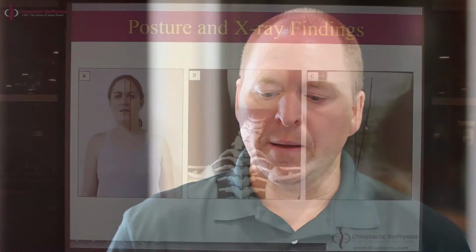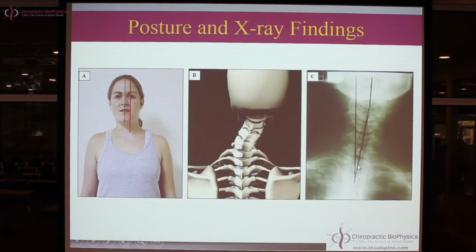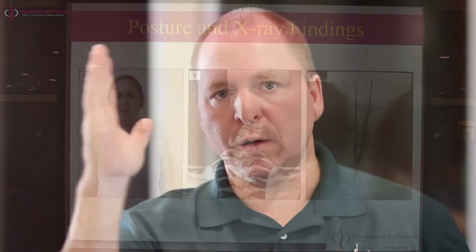So our range of motion was 30 to 31 millimeters to C3. If I go to C2, it's probably going to be more like 34 or 35 millimeters as a maximum range of motion. Then if I go in the lower neck, C5 all the way down, you'll see that the lower neck will bend to the side the head is shifted towards. So I see a tilt angle towards the head shift posture, and then C4 will bend back the other way. So I look for this pattern.